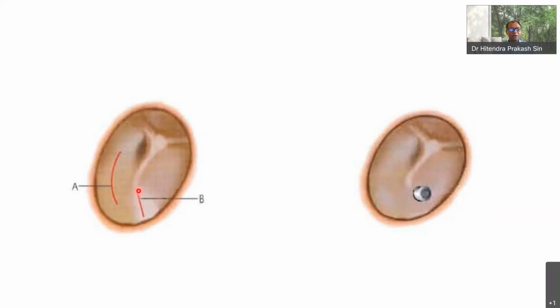So we put a radial incision like this in cases of otitis media with effusion or serous otitis media. In acute suppurative otitis media, we usually prefer posterior inferior quadrant incision, which is along the transverse curvilinear incision. This is how we put a grommet. After putting this incision, we put a ventilation tube or grommet.